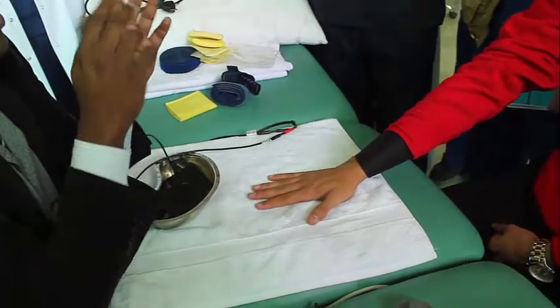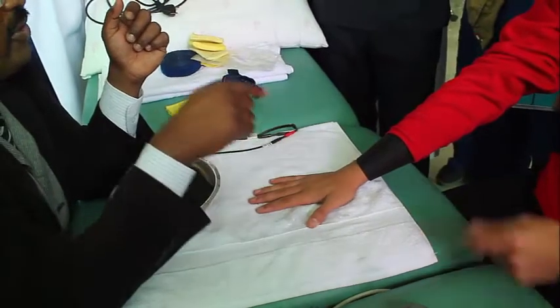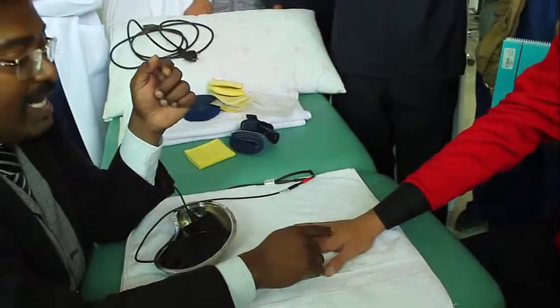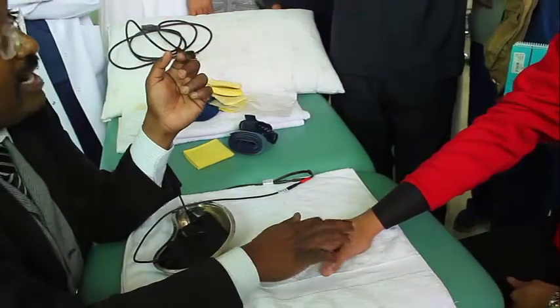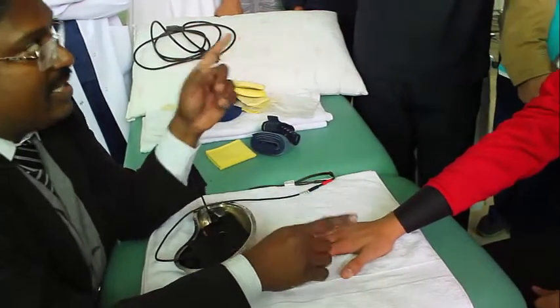Now you have to go inside the body. When you have to go inside the body, skin has to permit the current. If skin doesn't permit the current, because it is a resistant material, the electrical current will accumulate more and it will cause burn or damage in that particular area when you don't decrease the resistance of the skin.